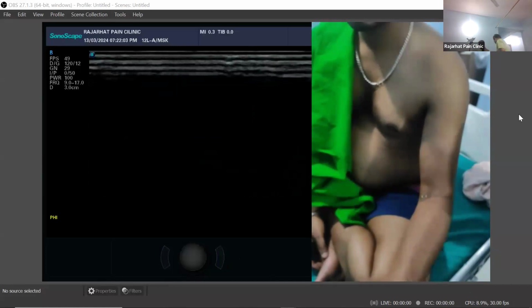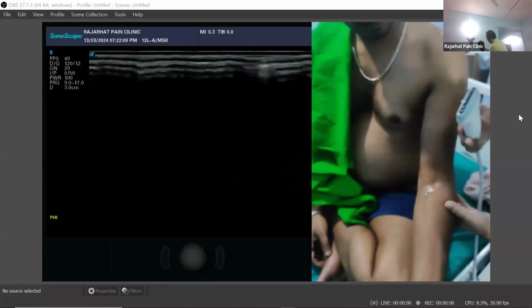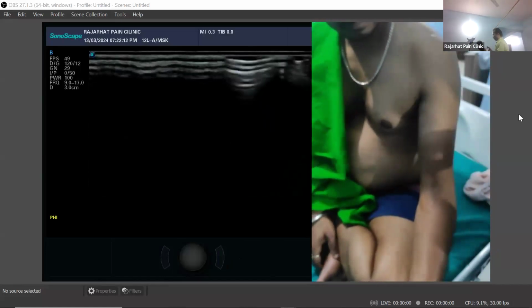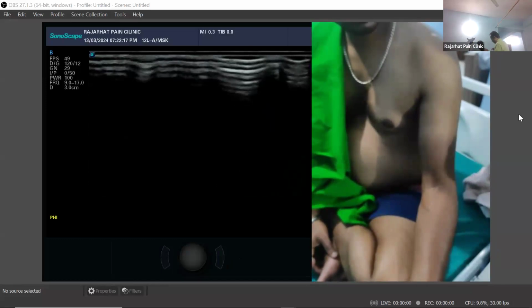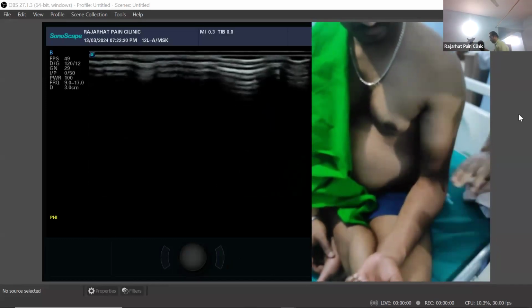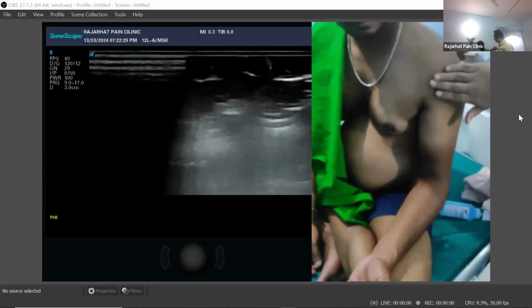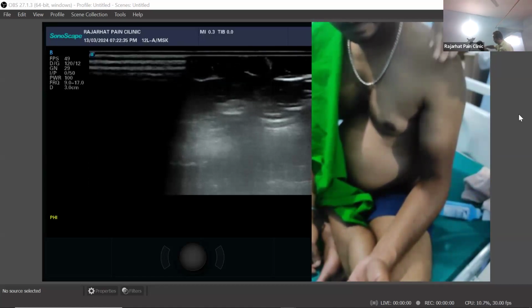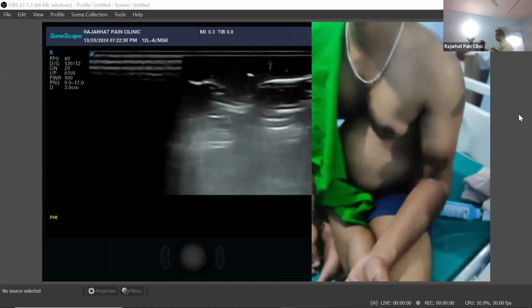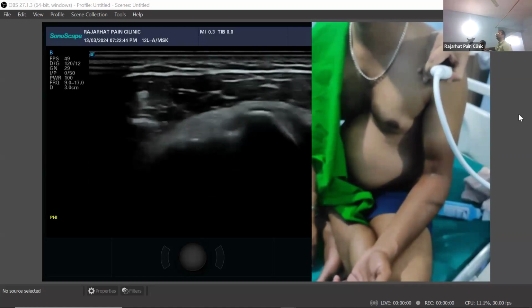Is there anything else I have not shown you? Just another thing, anisotropy. As I told you, I showed you the heel toe maneuver, but another is gliding. That is also done for anisotropy only. Here you have seen the structure bent in this way, but it can be bent in this way also. Then you will see there is a structure here which is black.